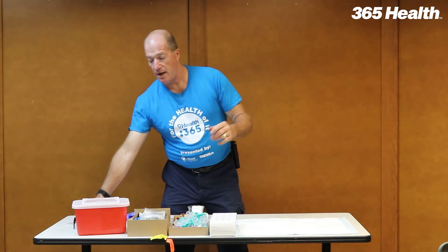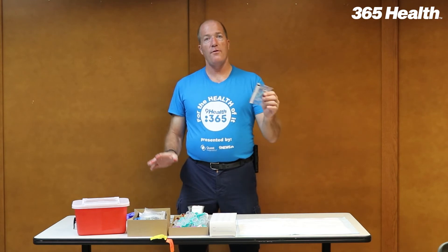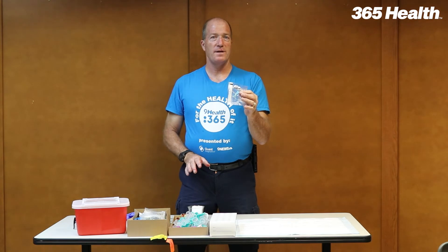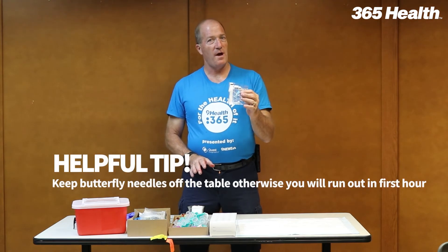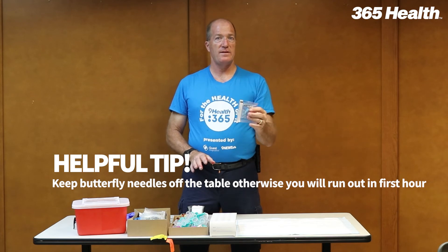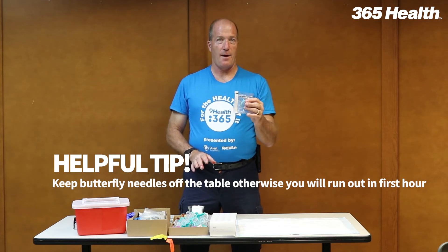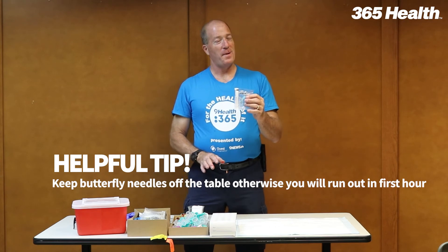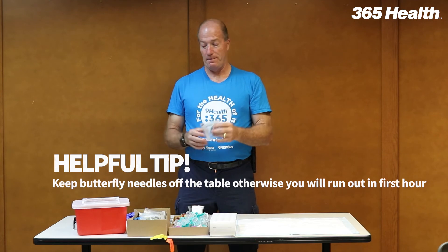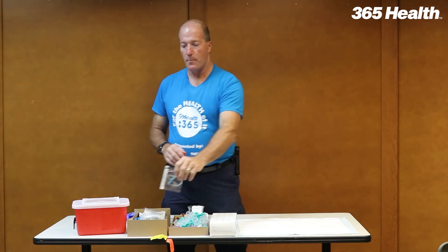And that's it for setting up the tables — other than I personally collect all of the butterflies, because there are only about four per phlebotomist. If we leave these out on the table, we will lose all our butterflies in the first hour, and then all the people that really need butterflies will be the last ones coming into the fair. These are valuable and in limited supply, so I'll put them aside.